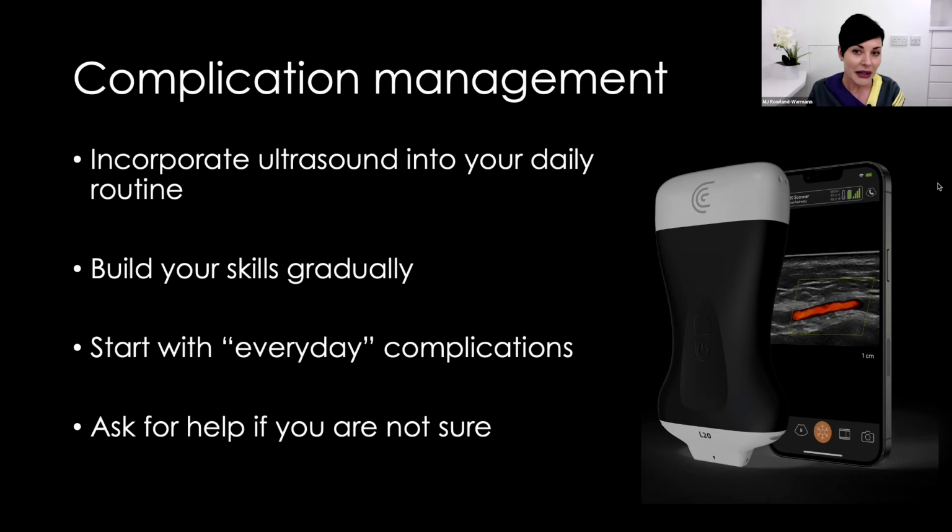So some of you may be handling complications already with your Clarius. For many of you, complications might be a new thing, or ultrasound might be new. So how do you go from simple scanning to managing complications? The best way is to incorporate ultrasound into your daily practice. Make sure you're using your Clarius every day for the simple stuff, recognizing anatomy and vascular mapping.